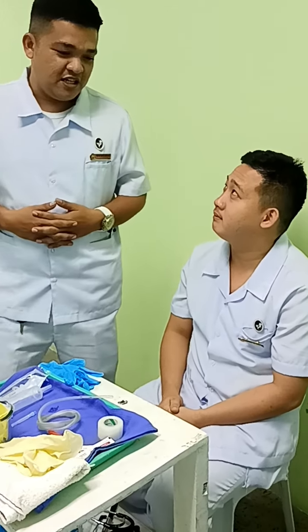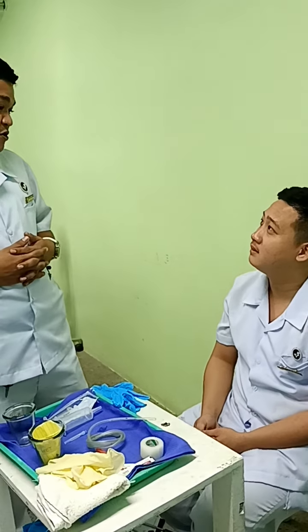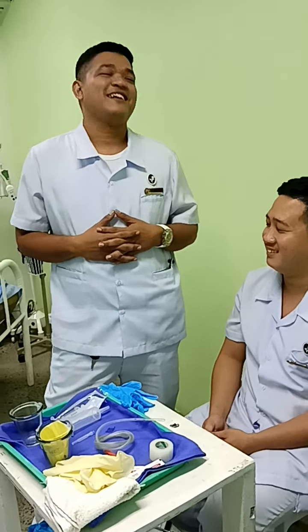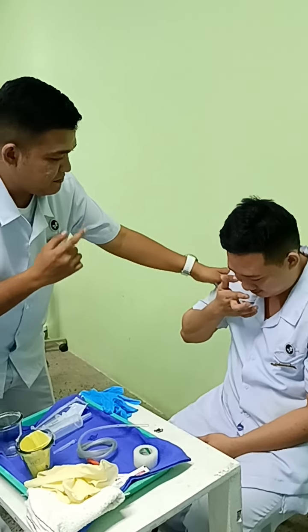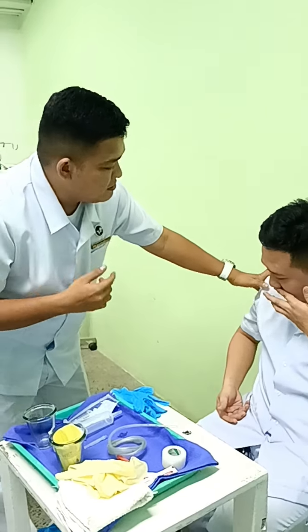First things first is to verify the patient's need for enteral feeding, and next is to assess the patient's skin for breakdown of skin integrity, as well as the patency of the nostrils. We also have to check if the patient's nose is occluded, one nostril at a time. Sir, can you please cover one of your nostrils? Okay, inhale. Exhale. How about the other one, sir?